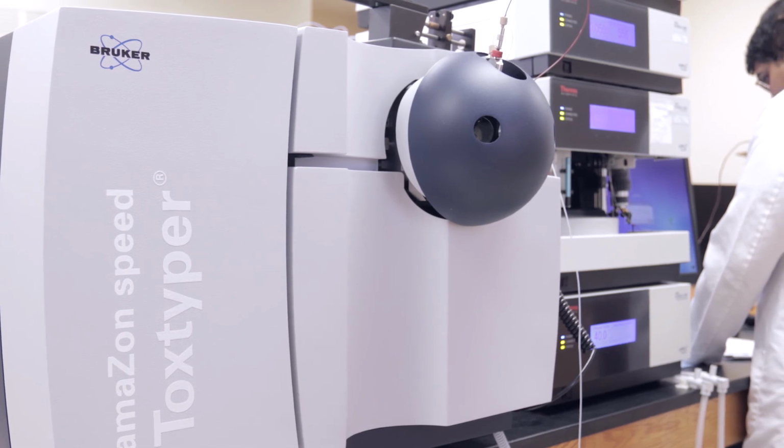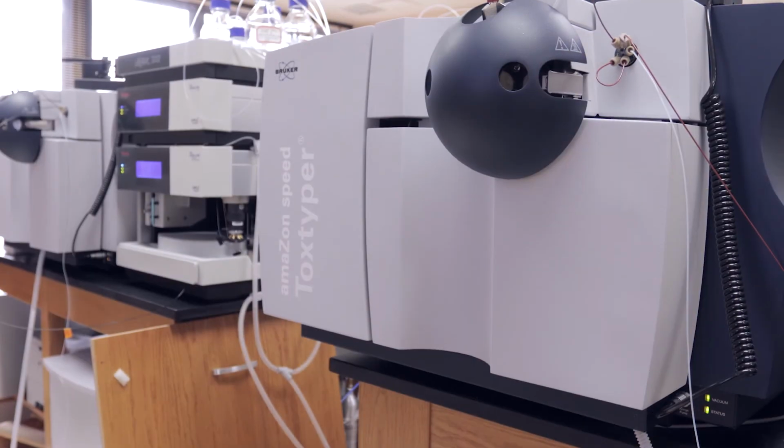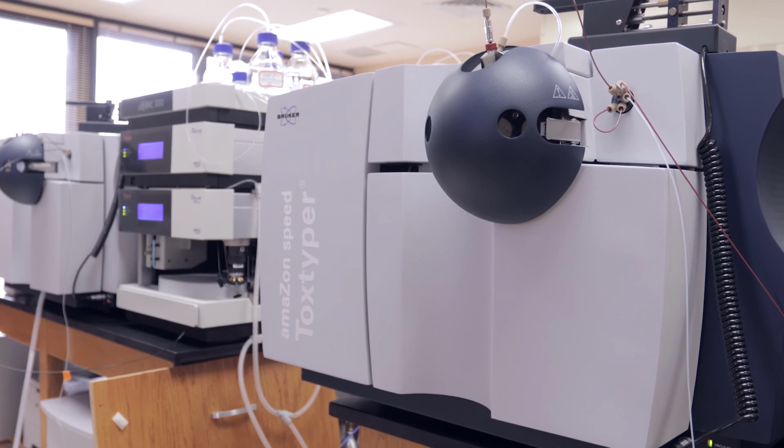The idea that it's an ion trap improves our identification because we can get degrees of MS second, MS to third, which really improves our identification of these things. But I think the biggest advantage is it's really opened up an enormous scope of things that we can identify fairly simply, quickly, and with a great deal of confidence.